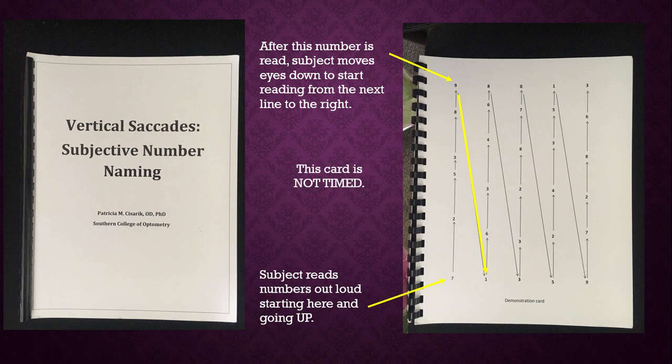This card is not timed, but everyone should go through the card so their visual system and their mouth kind of knows what to do as part of the test. So have everybody complete the demonstration card.